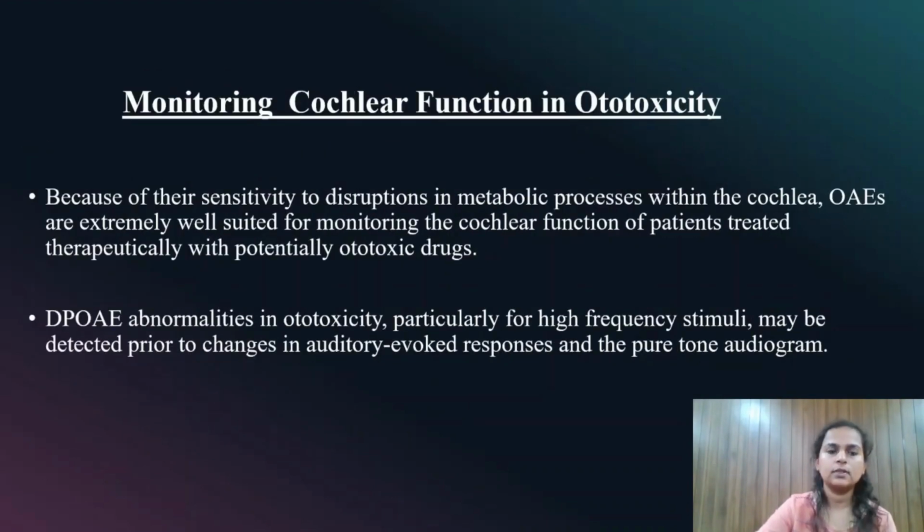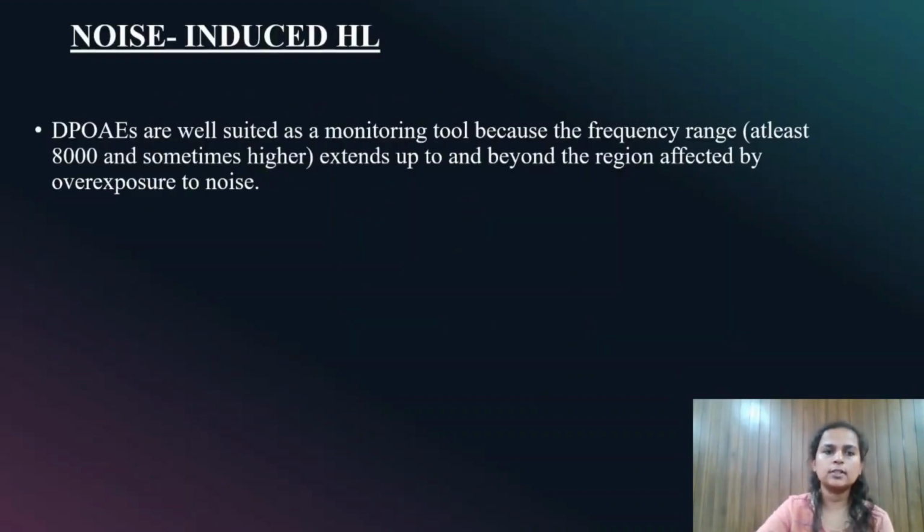Monitoring cochlear function in ototoxicity. Because of their sensitivity to disruptions in metabolic processes within the cochlea, OAEs are extremely well suited for monitoring the cochlear function of patients treated therapeutically with potentially ototoxic drugs. DPOAE abnormalities in ototoxicity, particularly for high frequency stimuli, may be detected prior to changes in auditory evoked responses and the pure tone audiogram. For noise-induced hearing loss, DPOAEs are well suited as a monitoring tool because the frequency range extends up to and beyond the region affected by overexposure to noise.